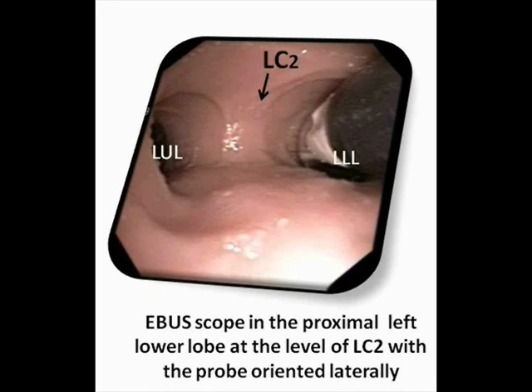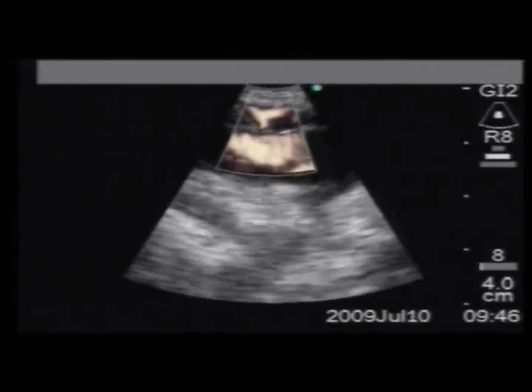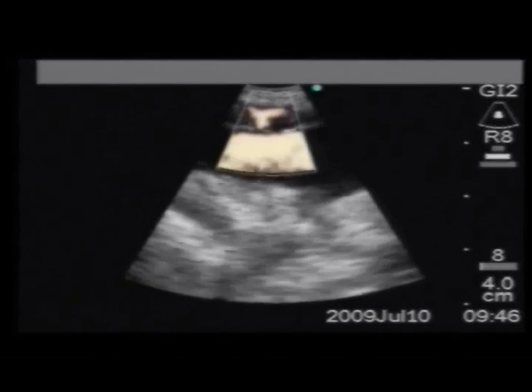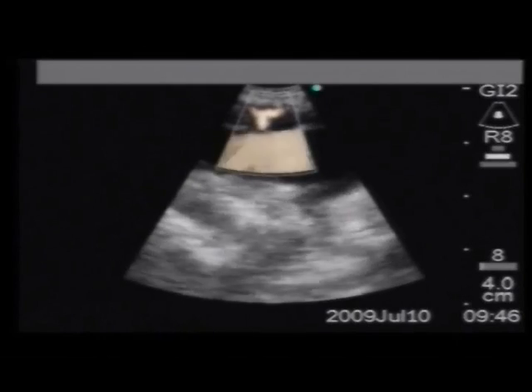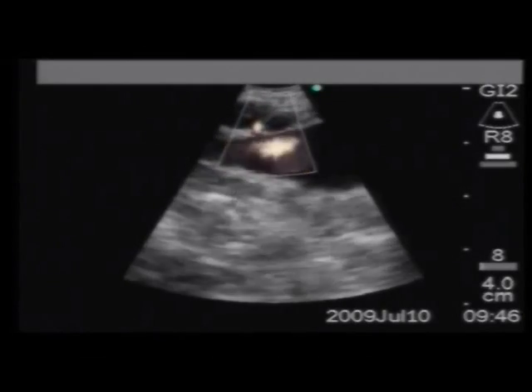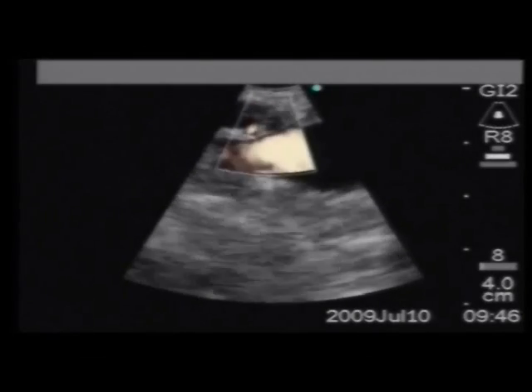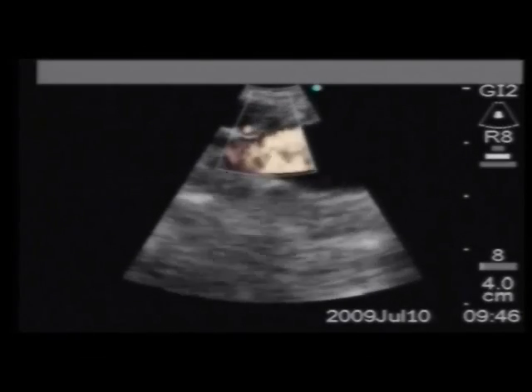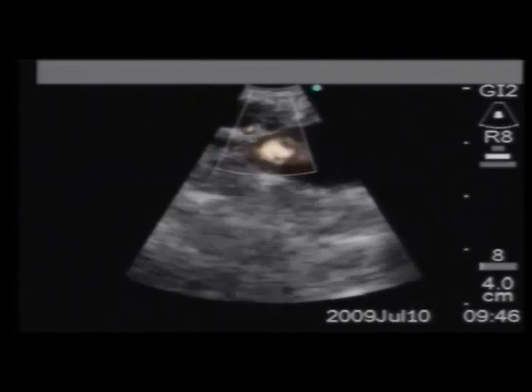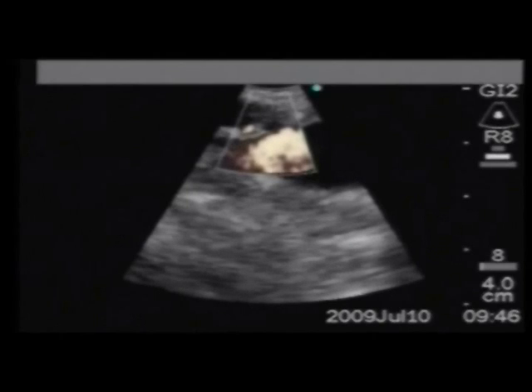Investigation on the left also begins in the lower lobe bronchus. With the transducer facing the lateral wall, the left lower lobe pulmonary artery is seen. This video shows a small 11L lymph node and the left lower lobe pulmonary artery using Doppler mode.